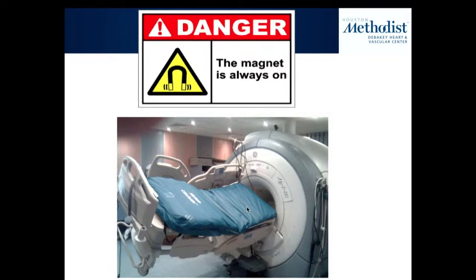So you actually have to take this scanner, turn the magnetic field off, right? Now the problem is it's not like turning it off is just pushing a button. It's not like an on-off switch, right? There's a huge step to turn it off, and then to turn it back on again will take 3 weeks, okay? So the magnet is always on. So if you go to the MRI suite, it's Sunday night, all the lights are out, the computer console is turned off, the magnet is still on, okay?